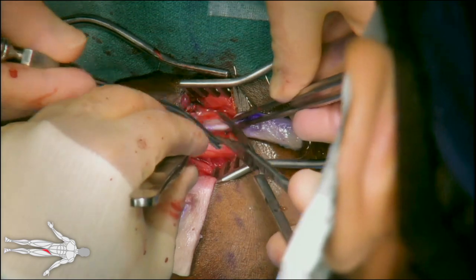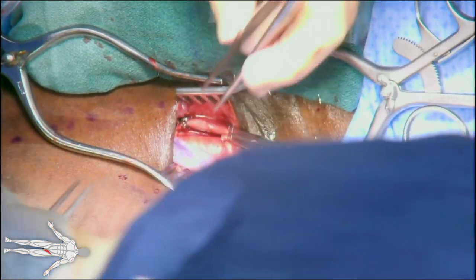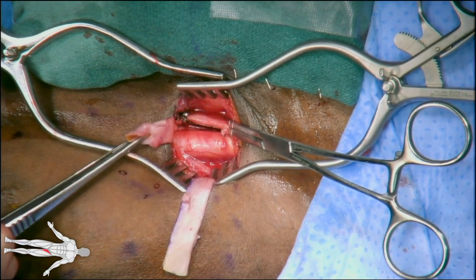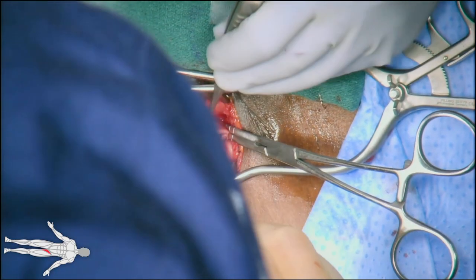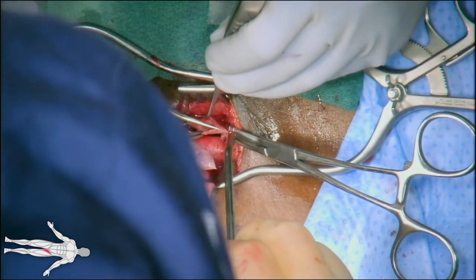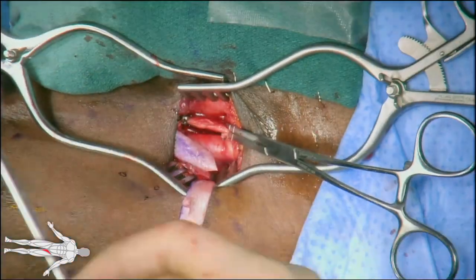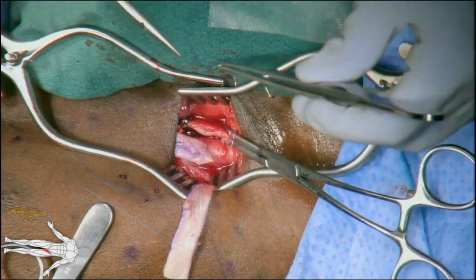Next the venous limb of the graft is beveled. A side-biting clamp is placed on the common femoral vein and 5000 units of heparin are given. We then proceed with making a venotomy in the common femoral vein. This venotomy is then extended proximally and distally with Potts scissors. Next, stay sutures are placed in the common femoral vein.